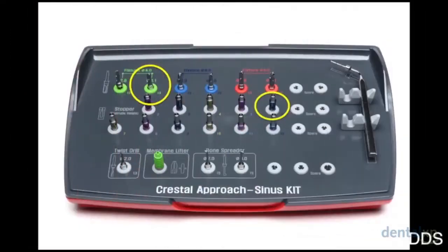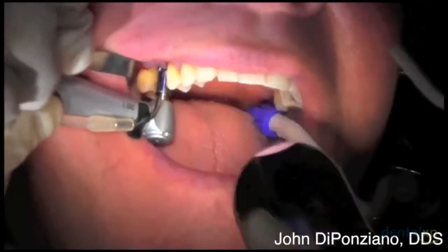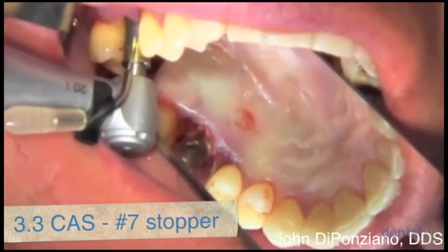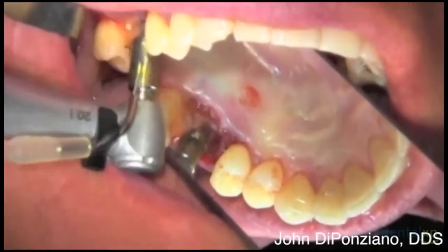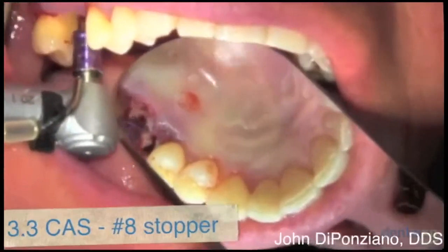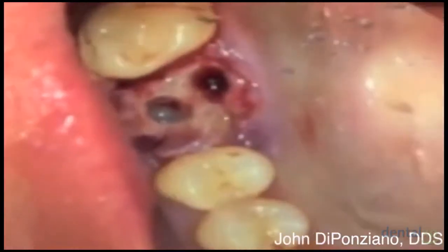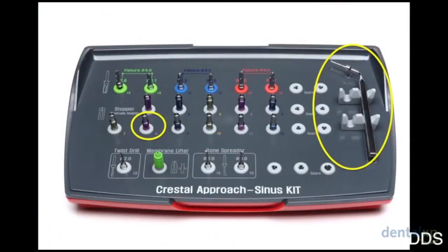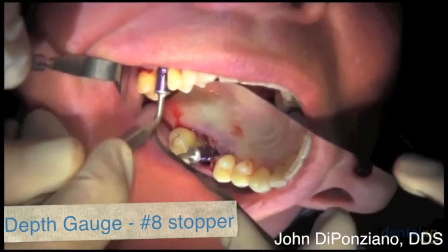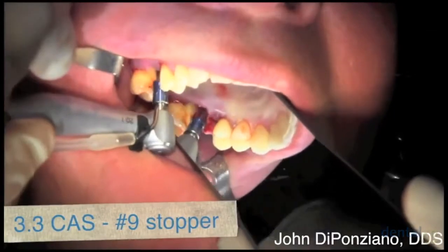You can see there's still bone there. Now we go to the 3.1 CAST drill with the number six stopper to enlarge the osteotomy and go one millimeter deeper. Then the 3.3 with the seven millimeter stopper, just enlarging slowly and progressing one millimeter toward the sinus. Now we go to the number eight stopper. You can see some gray, so we're getting very close to the sinus. Checking with the depth gauge using the same number eight stopper — it still feels like solid bone, has not reached the sinus. So we go to the nine stopper using the same 3.3 CAST drill.